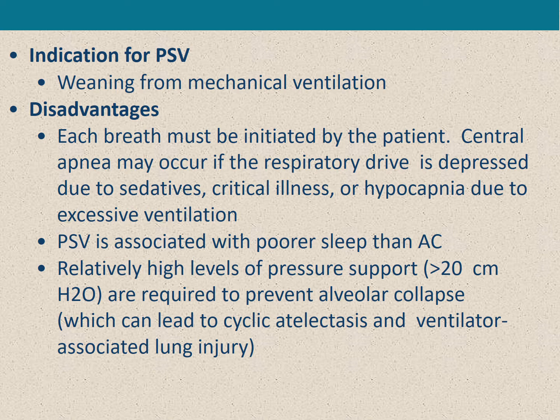The main indication of pressure support is weaning from mechanical ventilation. But there are some disadvantages: pressure support ventilation is not an ideal mode for patients with unstable respiratory drive or hypopnea. Also, if the patient is severely hypoxic and needs a higher pressure, pressure support ventilation may not be ideal.